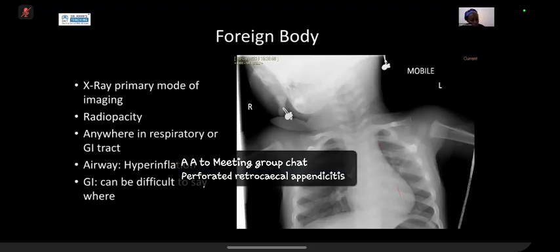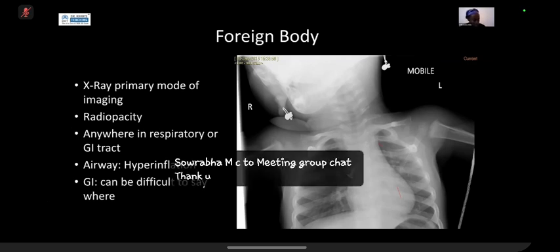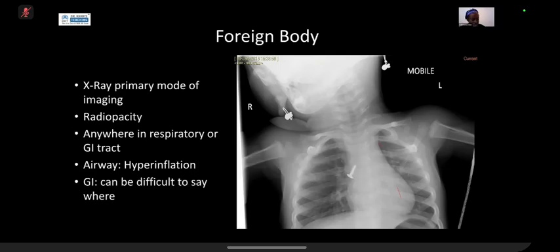So we used to do just an abdominal radiograph initially, and a chest radiograph if you saw nothing on the abdominal radiograph but we're concerned that they'd ingested a foreign body, just to see where it was. And then if we saw a single ingested magnet on the radiograph, we would then do a lateral of the abdomen to see if there's multiple magnets, because you can get magnets that stick to each other and look like one single magnet on the imaging.